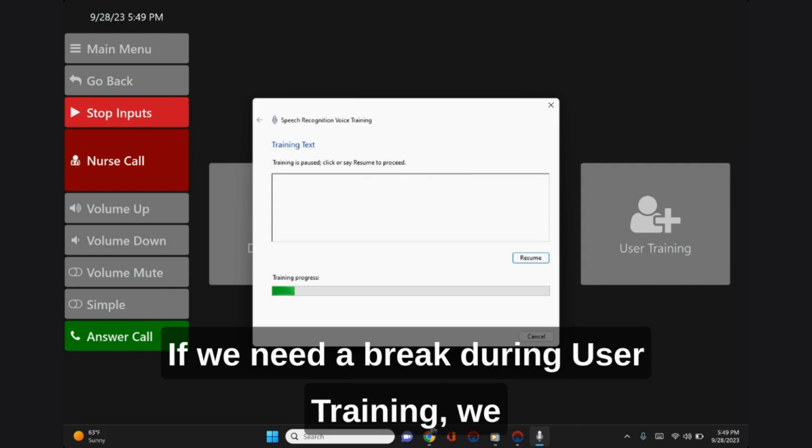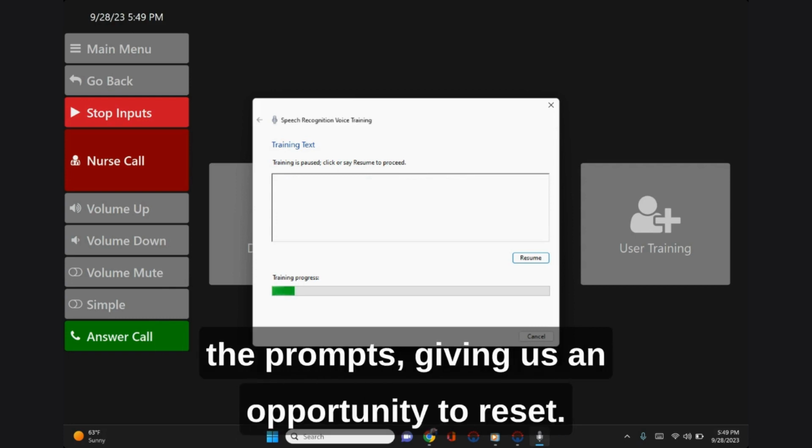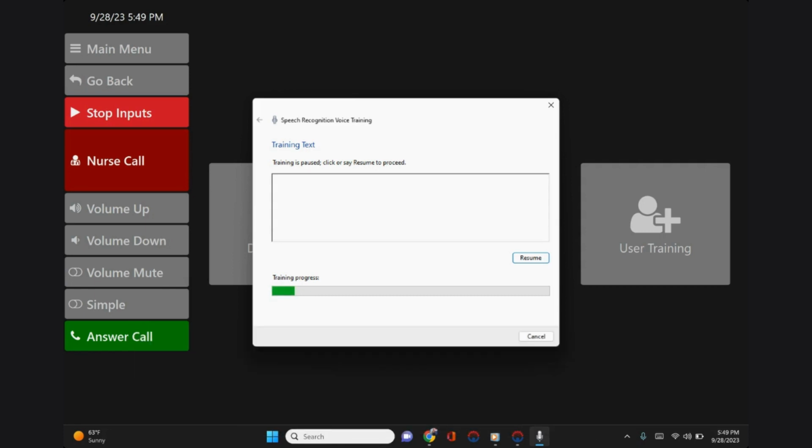If we need a break during user training, we can simply say pause and the program will pause the prompts, giving us an opportunity to reset. When we're ready to begin, we can say resume. Resume.